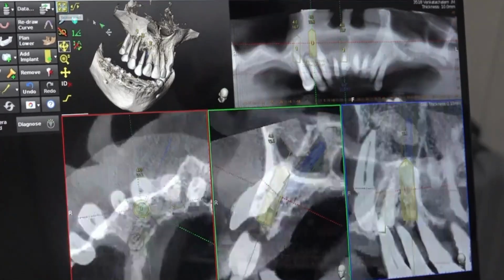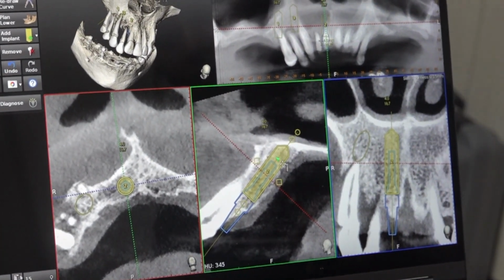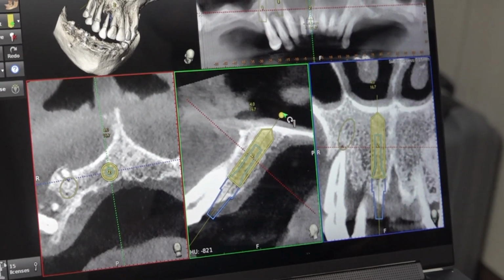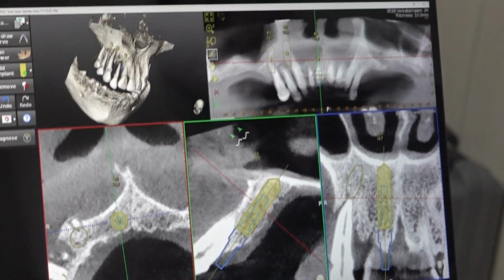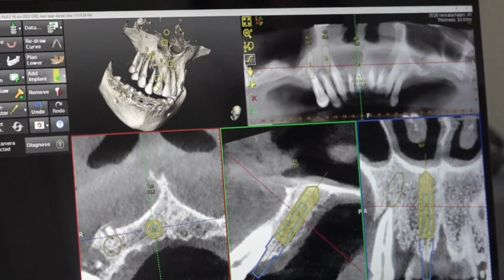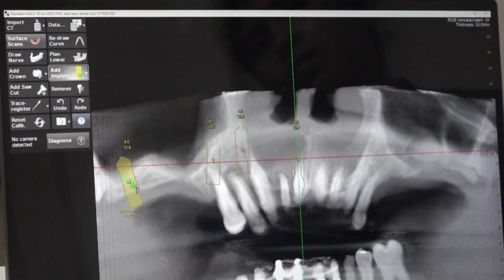Okay, we will check the one implant one more time. Even this you can manipulate, no? You can come closer to the labial or go palatal. In this way you can avoid implants close to each other. So right side is okay. Do we need a pterygoid? Okay. You can place a pterygoid or you can avoid a pterygoid.